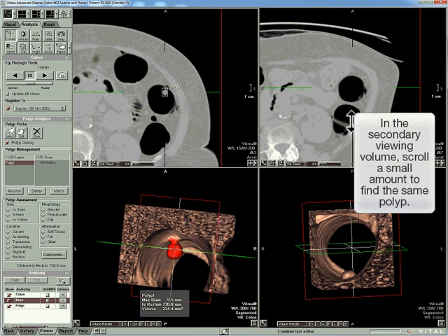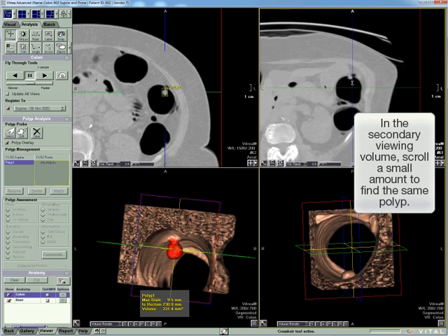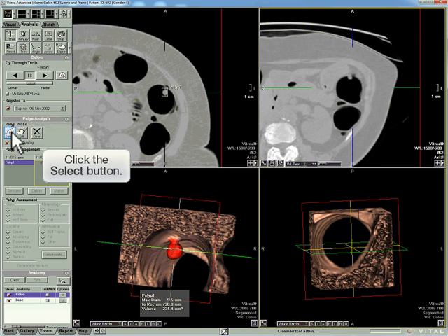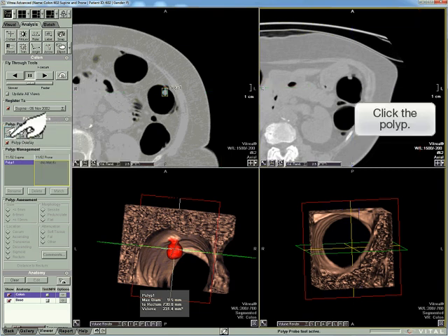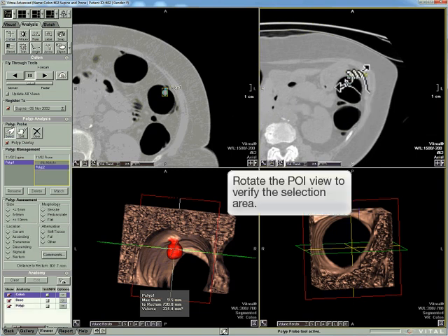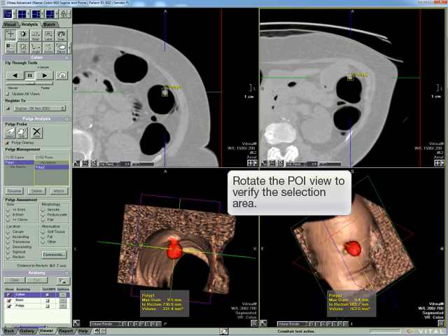In the secondary dataset, scroll a little to find the same polyp. Click Select. Click the polyp in the secondary view. Rotate the secondary POI to verify the selection area.